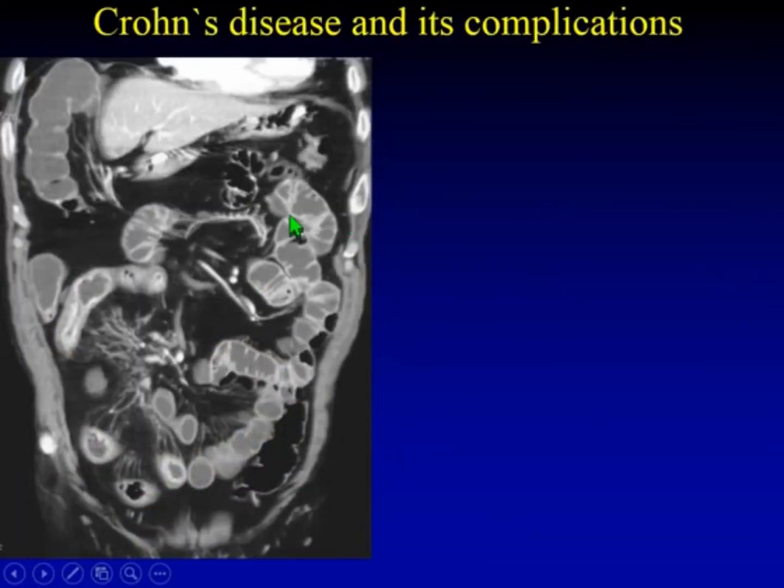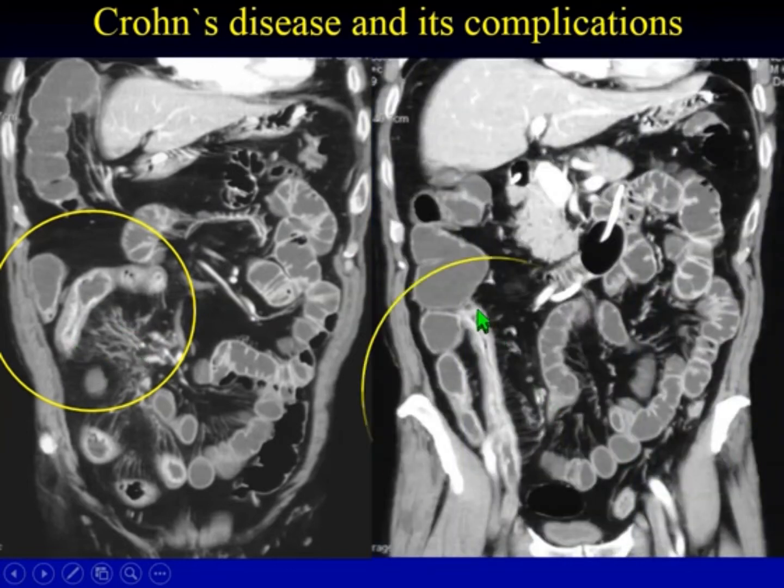Normally, if we are facing a typical pathology, and if we perform a good examination from a technical point of view, the diagnosis is not so complicated in my opinion, because we may detect the skip lesion, the thickened aspect of the last ileal loop, the hyperemia of the mesentery, the last ileal loop involved, some nodes, and the comb sign. All is easy and understandable.